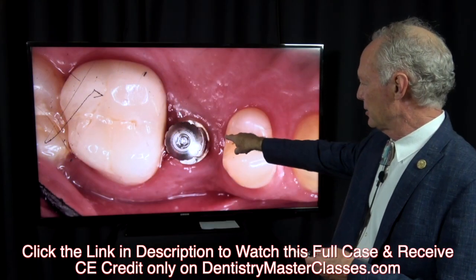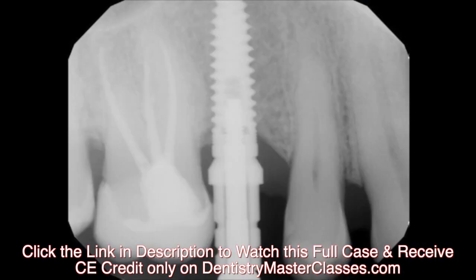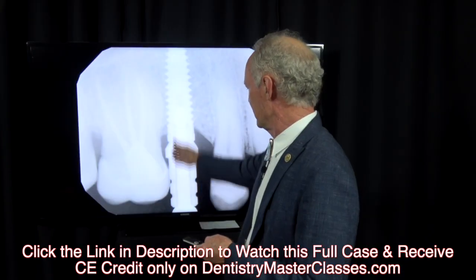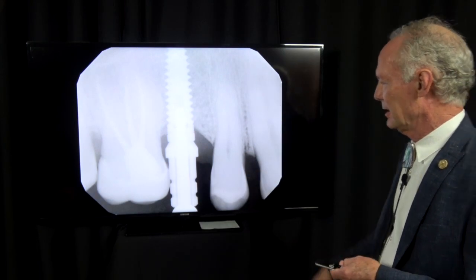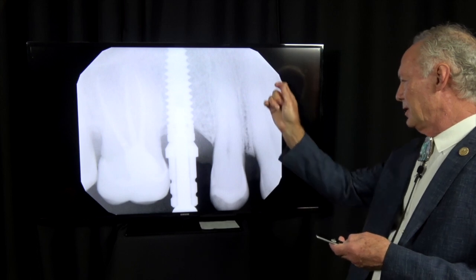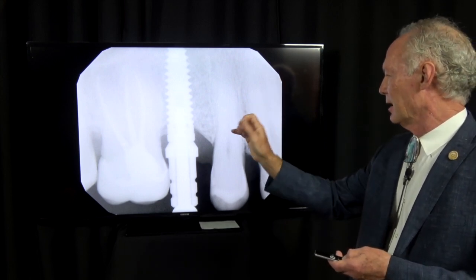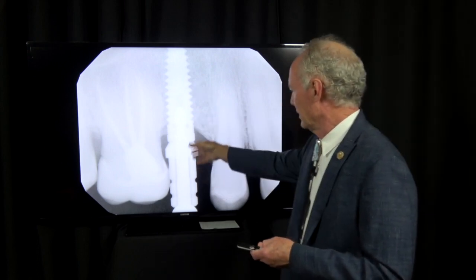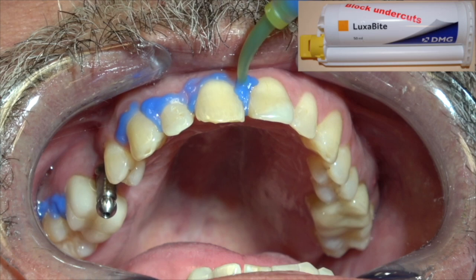This is the impression coping screwed into the implant — it's not touching that tooth, it's just the angle. I take a radiograph just to be sure it's completely seated, but it always is, because when you put the impression coping into the implant you feel it lock when the hex engages the coronal part of the implant.